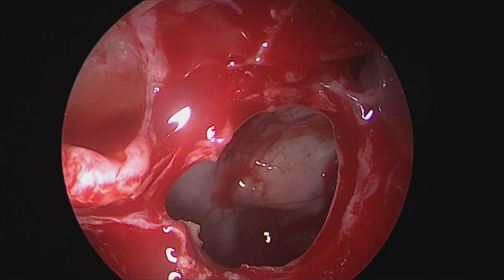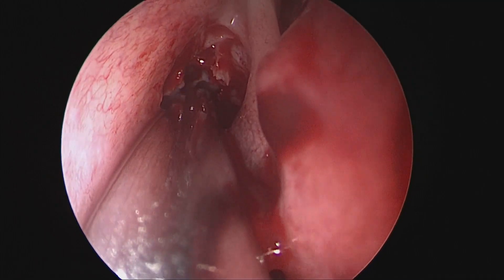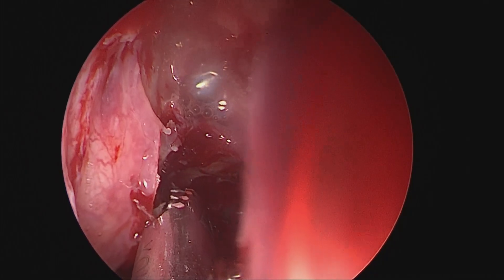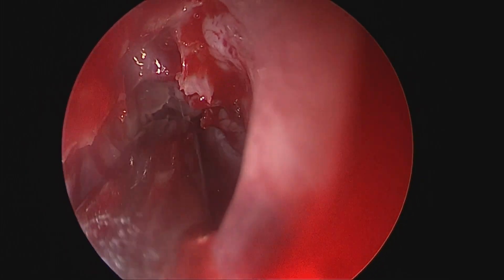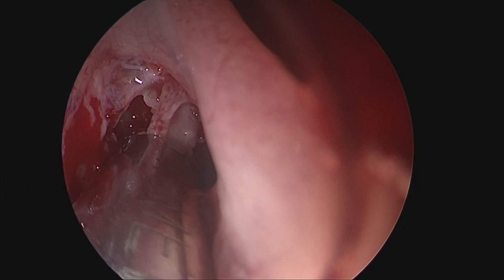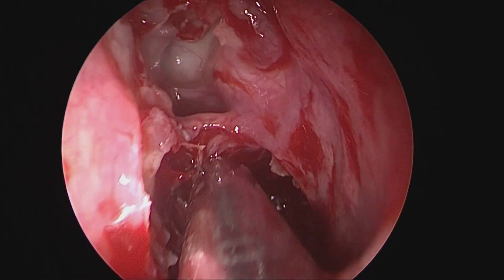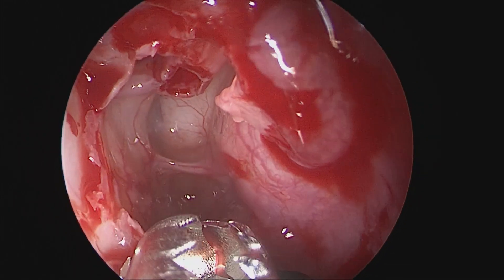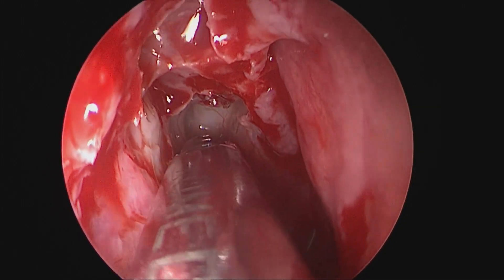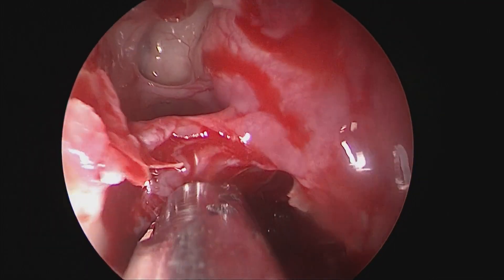One can already start seeing the sellar bulge inside the sphenoid sinus on the right side. Having seen the level of the roof of the sphenoid sinus, we come back anteriorly where the lateral boundary is the lamina papyracea, and we start dissecting cells one by one to open the frontal recess. There is a single cell medially pneumatizing inside the frontal sinus, akin to an interfrontal sinus cell, shifted toward the right side, along with a frontal buller cell — an anterior ethmoidal cell pneumatizing along the posterior wall of the frontal sinus.